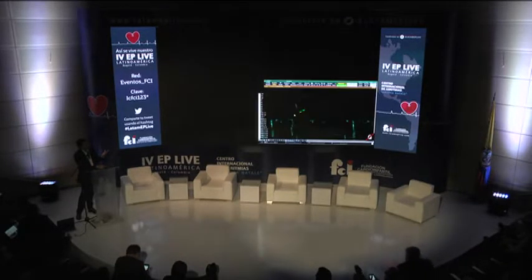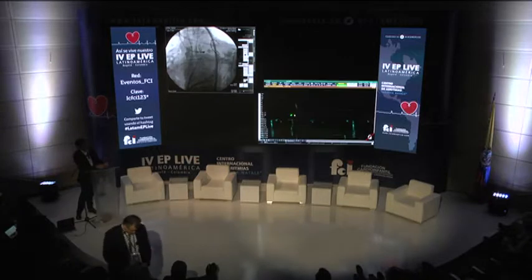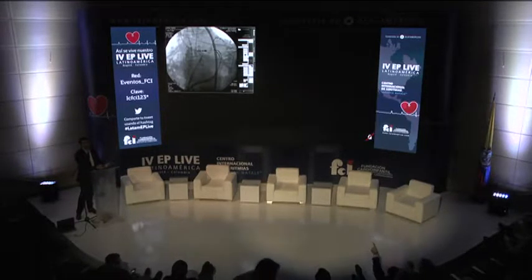The fastest deflection of the electrogram, whether positive or negative, when we compare unipolar and bipolar, is extremely helpful. Usually, the peak of deflection, whether positive or negative, of the major initial deflection of the bipolar is consistent with the maximum dV/dt of the unipolar. Usually, it's in the fastest area of the unipolar, and this is the way we do it.